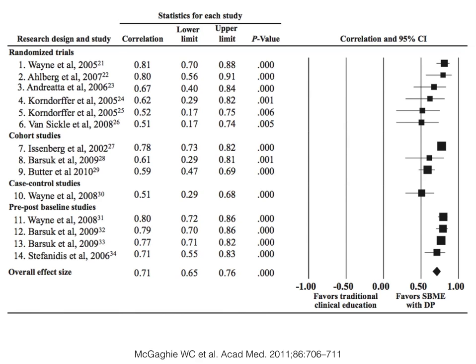Simulation, if you look at this study back in 2011, they looked at traditional clinical education versus simulation-based medical education with deliberate practice, or SBME with DP. That's what that notation means. And in all these studies, simulation with deliberate practice performed better than traditional clinical education. So it seems like a no-brainer that we're going to incorporate simulation and deliberate practice.